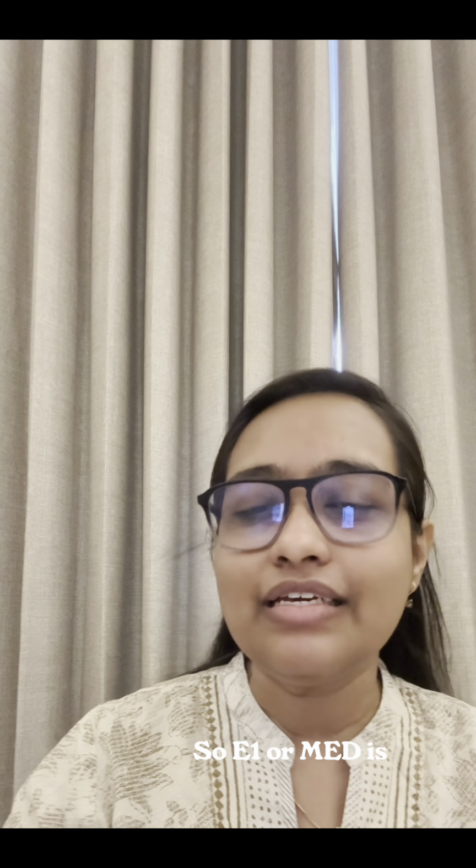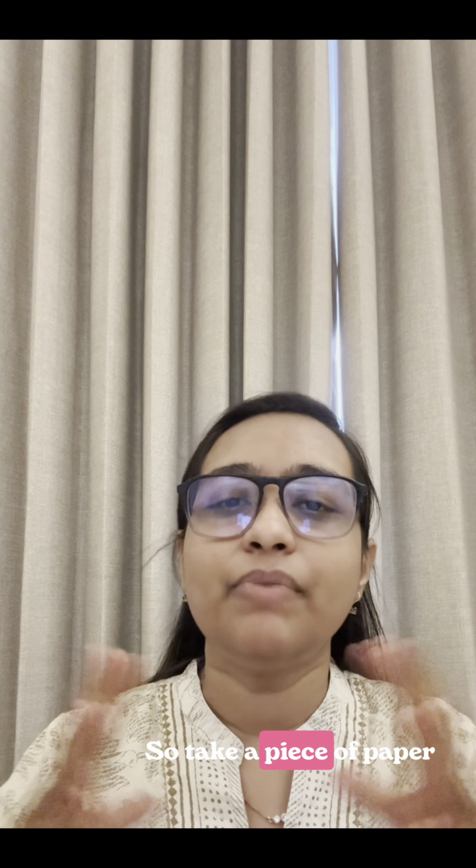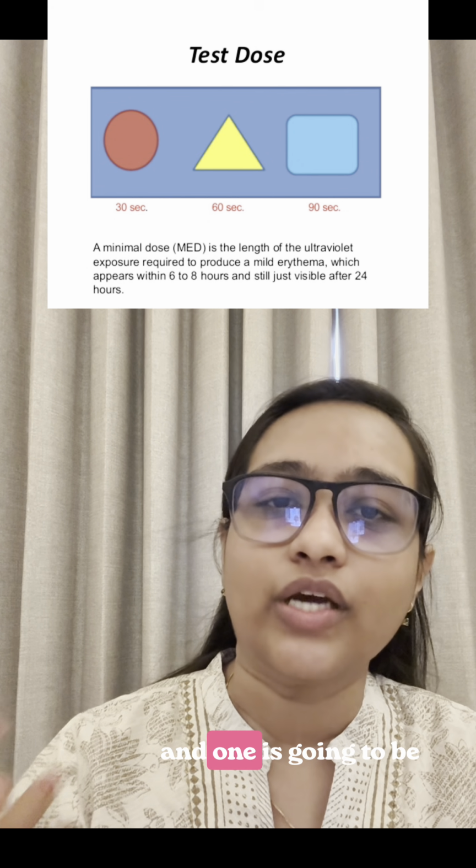So E1 or MED is minimal erythemal dose. How do we decide that? This is not textbook language. This is just a way of explaining it in simpler terms. Take a piece of paper or a lint, cut it out in 3 different sizes and shapes. One is going to be smaller, one average, and one bigger. Put it on the anterior aspect of the forearm of your patient.